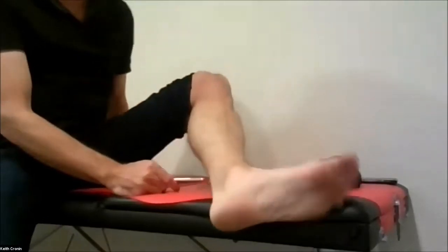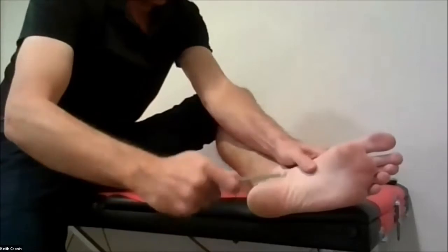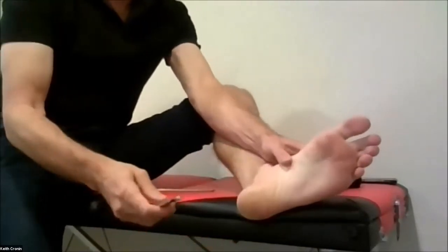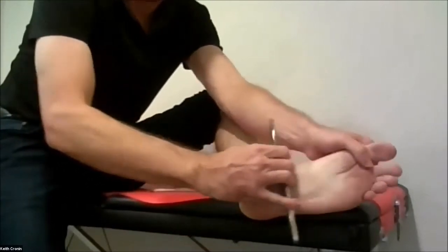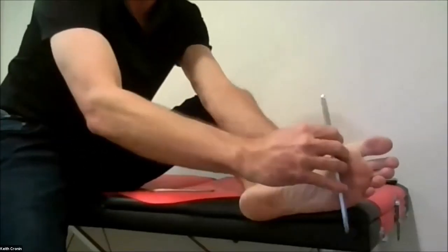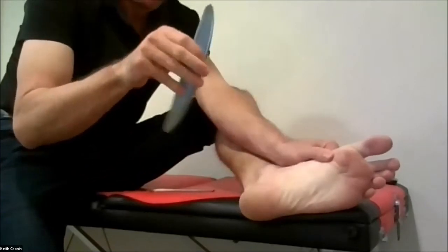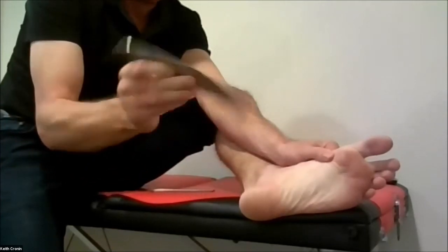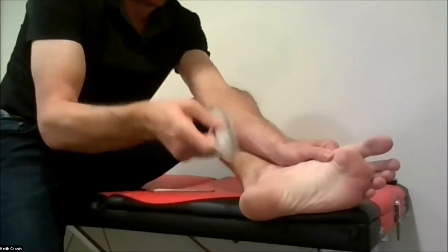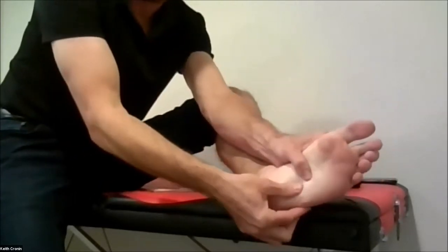And one of the best ways to do that is a really kind of a fun way where you take this tool, you press it in there, and you actually twist and turn it like this. And some people go, why the heck would you do that? Why would you spend so much time working through all of this tissue and using this really specific instrument? It's like, well, I can feel right there every single time I go over a little railroad track. I can feel that with this. If I don't have something that's as specific as this particular tool, I can't feel that. And by the way, when you get your fingers out, you can't feel that either.